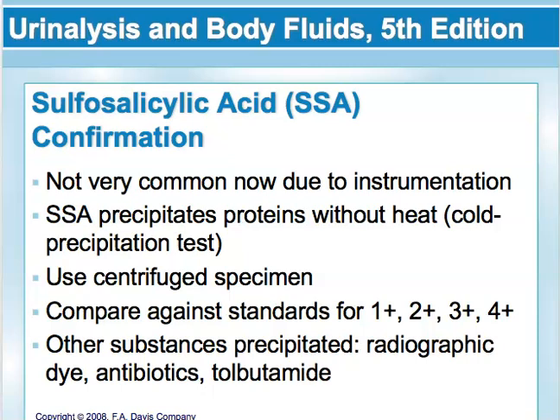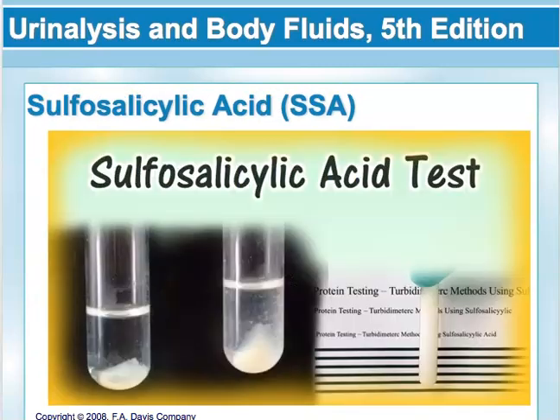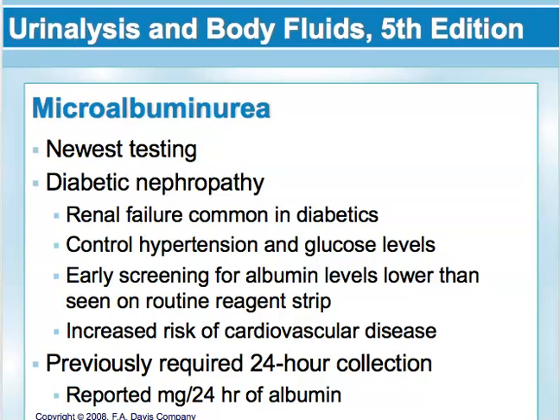It has to be performed on a centrifuged specimen, and this is really not a commonly used test anymore, and that's really just due to instrumentation. So a lot of labs don't perform this test anymore. But again, I think I mentioned there is a Moodle video on it if you want to take a look at it.